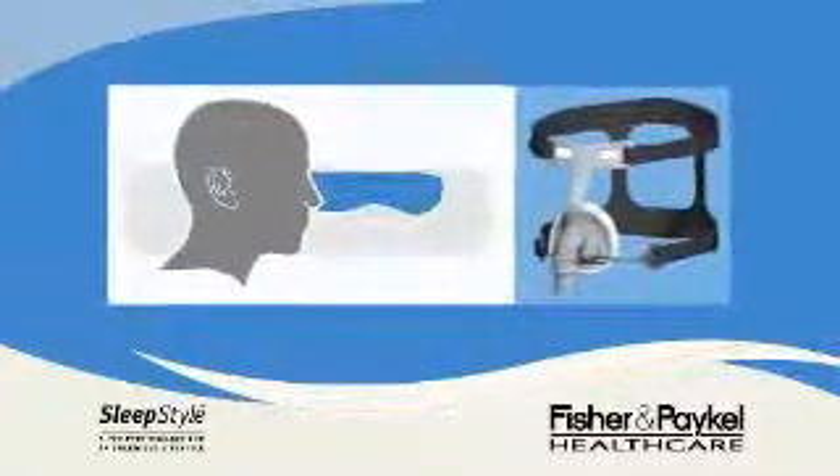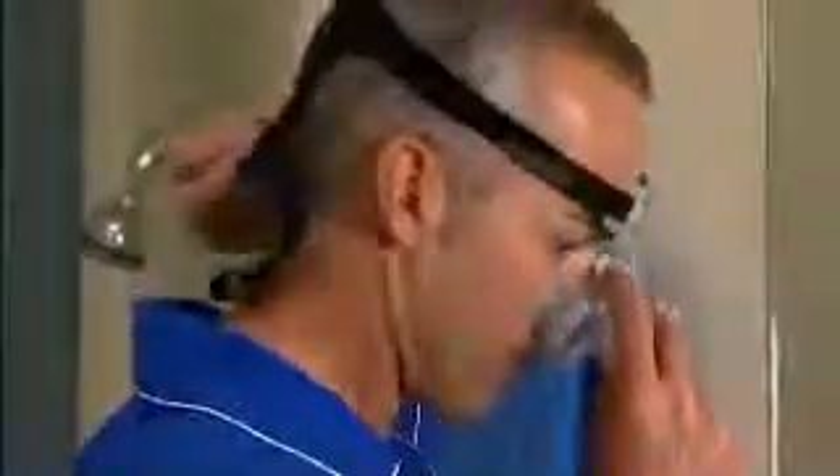You have received a nasal mask for delivery of positive pressure therapy through the nose. Your FlexiFit nasal mask incorporates FlexiFit technology with auto-contouring properties. This means it automatically adjusts to a wide range of nasal contours with simple, one-step, easy-fitting and no complicated adjustments.